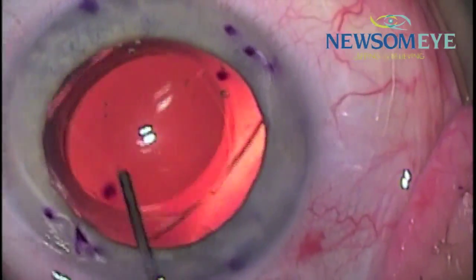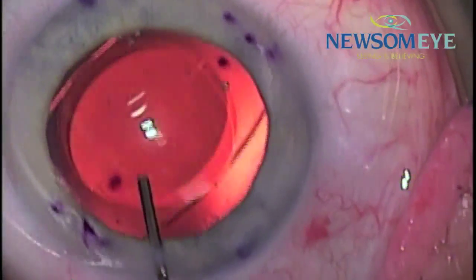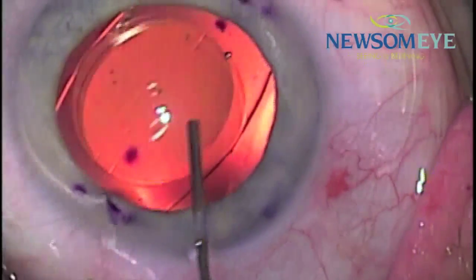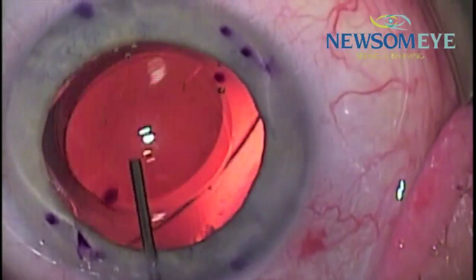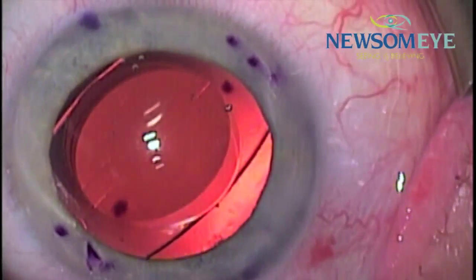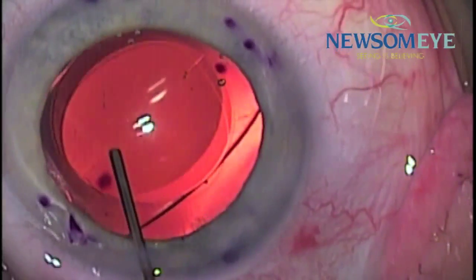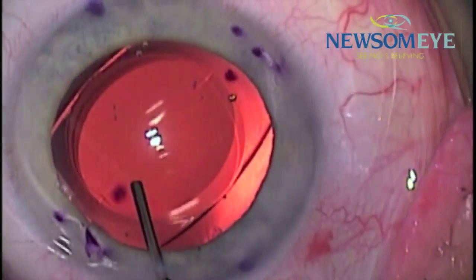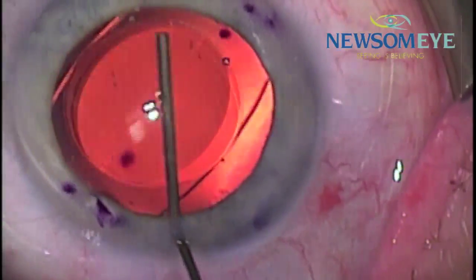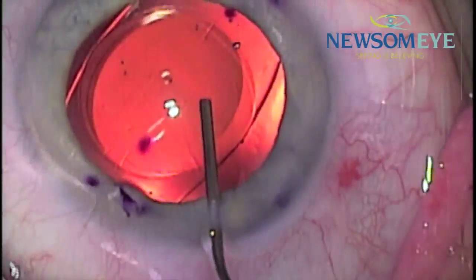We then want to fine-tune the positioning, because this is going to be lined up exactly with the patient's astigmatism, which we are doing here and fine-tuning. We ensure the appropriate amount of fluid is inside the eye for the lens to be in the proper position.